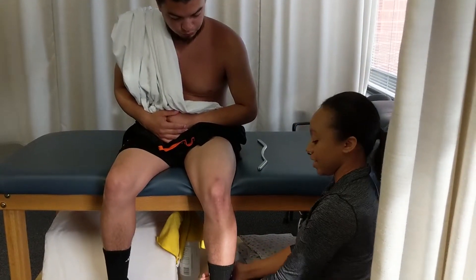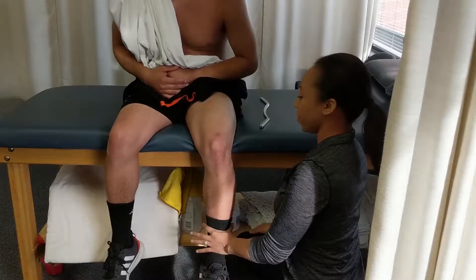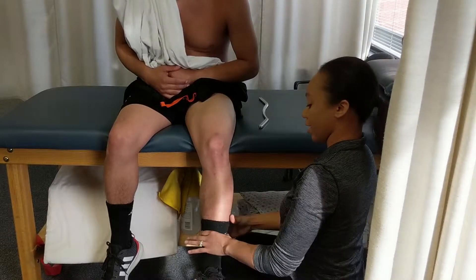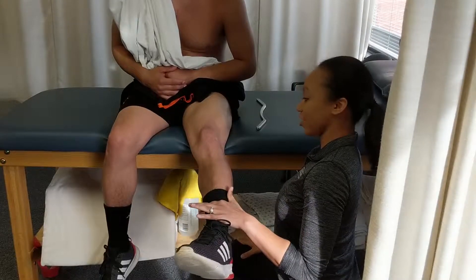After you go in and treat, you might do some isometrics. He would bend his knee and pull back — hold it for an appropriate amount of time, then push forward. Throughout that new range that we just gained, he might bring his leg up and hold. You might do that a few times.